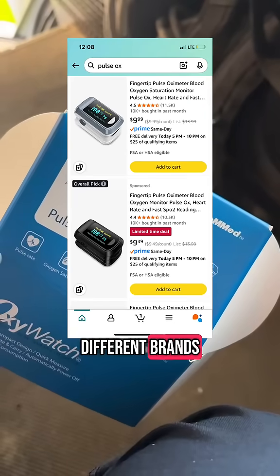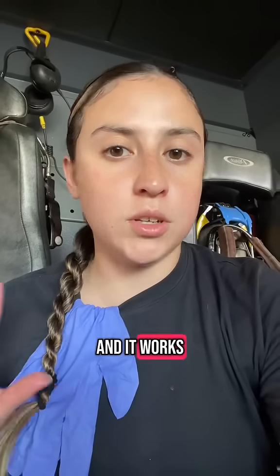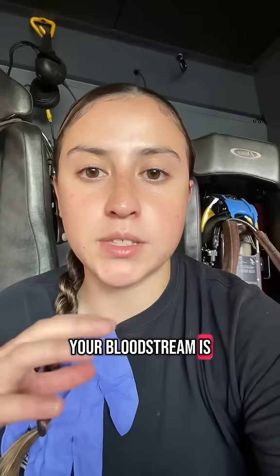They come in a lot of different brands. I'll attach one that you can buy on Amazon below — this is the one I'm using for this video, and I have this Amazon one at home and it works just the same. Speaking of how it works, it operates basically by measuring how much hemoglobin in your bloodstream is carrying oxygen.